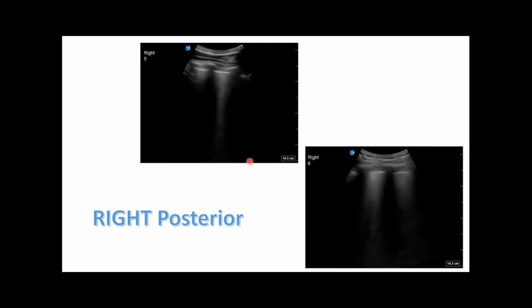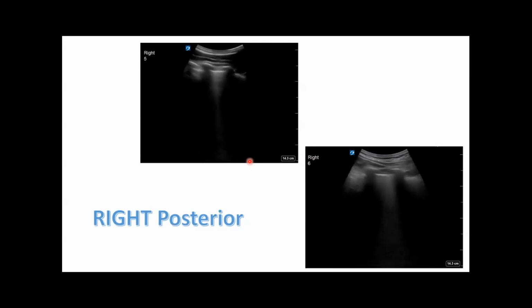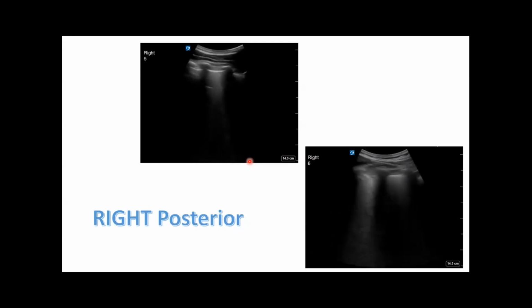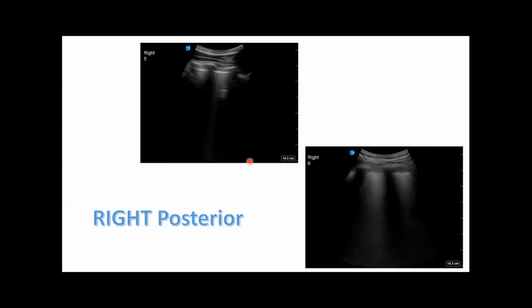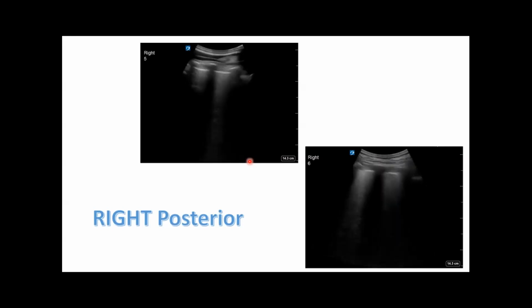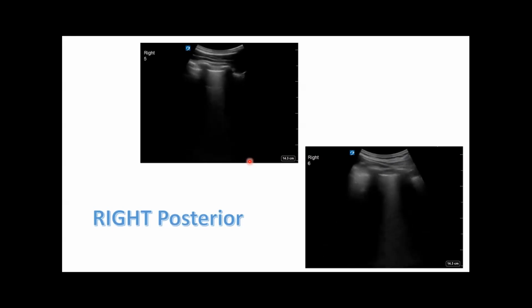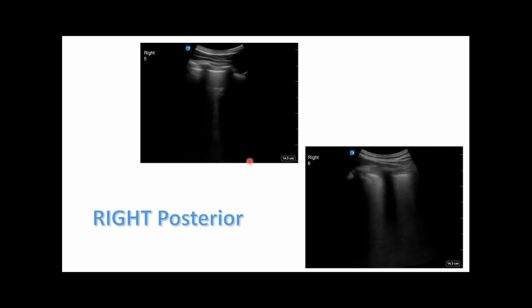For sure. So COPD patients should have no interstitial edema. Typically their lung profile is all A lines. So you have a patient who comes in with COPD exacerbation, you're going to see no B lines, you'll see A lines in all the lung fields. Mind you, if they have pneumonia, you may see B lines in one of your lung fields or consolidation in one of your lung fields. And that could be a patient with COPD and pneumonia.